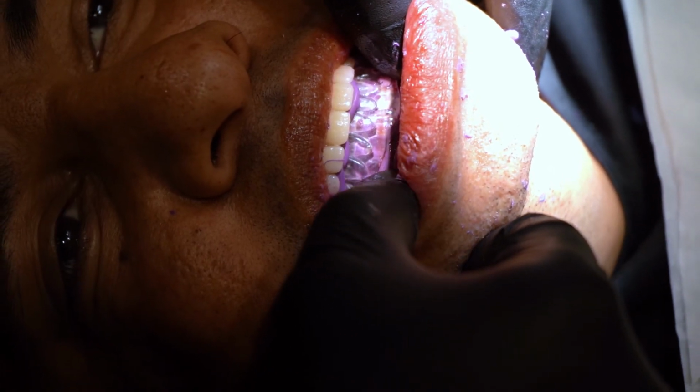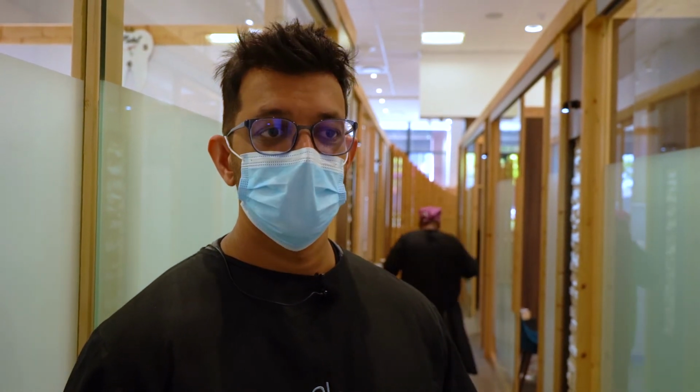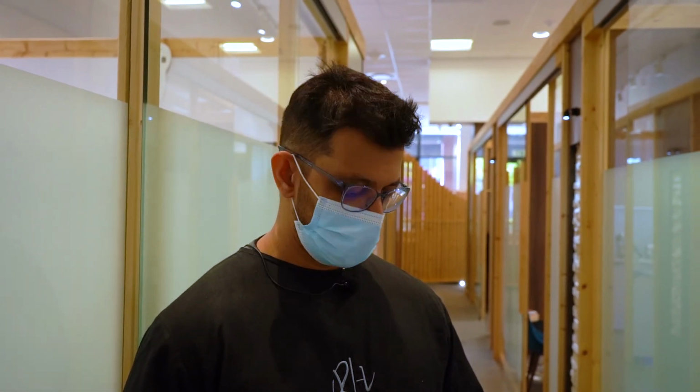It's obviously important that we get these teeth loaded. Immediate loading in essence is where you can load these implants within a week, but we want to get these implants loaded ideally within the first 48 hours before any swelling does actually kick in. So he will have a bit of pain this evening, but the swelling will kick in from 48 hours beyond, 48 to 72 hours. So we're going to get the prosthesis in before the swelling happens, so it makes delivery a lot more comfortable for him. But let's see how this goes.